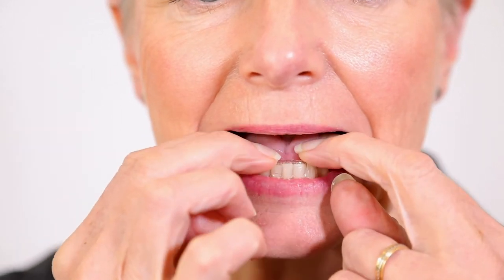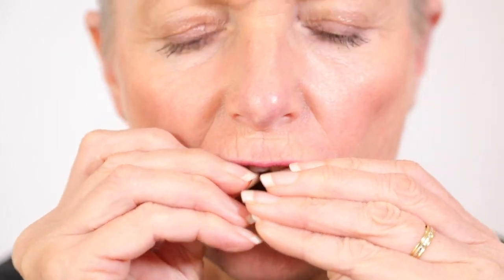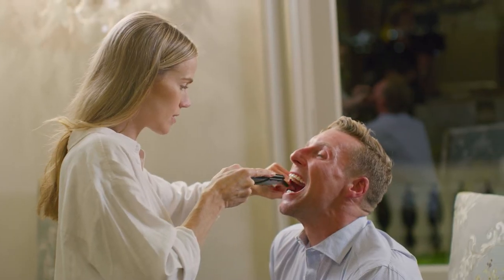The kit also has a powerful use in virtual monitoring of your clear aligner cases during active treatment, improving compliance and in subsequent monitoring of retention protocols and oral hygiene. The kit comes with the Demystify ALD nozzle, which can be attached to provide a powerful airflow to clear saliva and debris from the inside of aligners or other targeted areas.